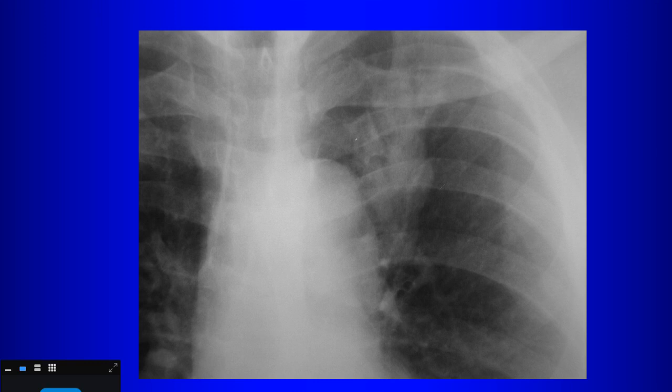Ciliary dyskinesia, again, is kind of like cystic fibrosis, gives you widespread abnormality. And that tends to be at the lung bases, interestingly, while cystic fibrosis tends to be uppermost. Congenital bronchial atresia, right, that can give you a focal area of mucoid impaction also. Malignant cause, a bronchial lesion, like bronchogenic carcinoma.